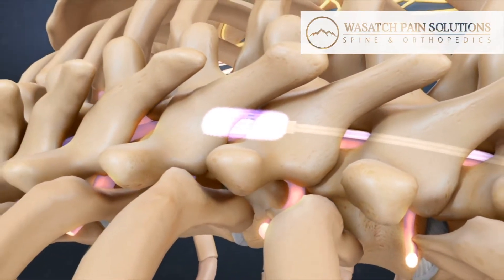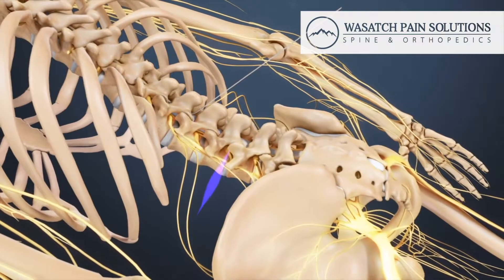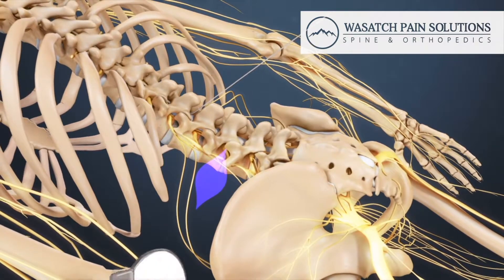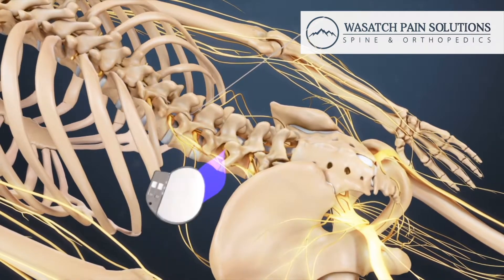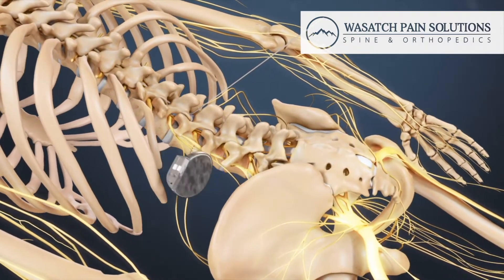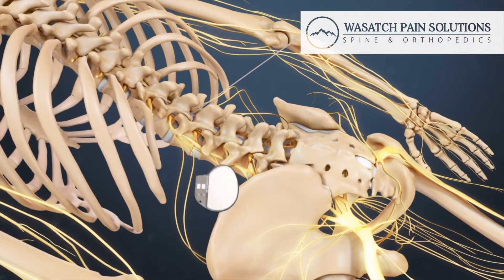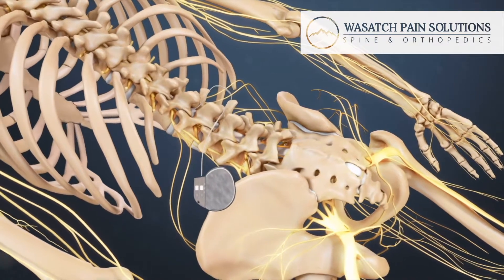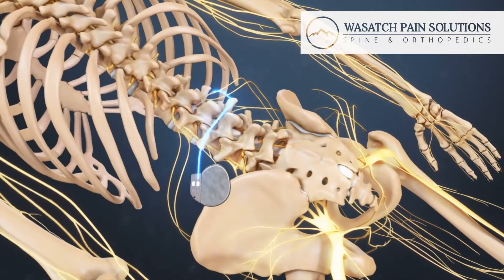Next, the surgeon creates a pocket between the skin and the muscle in the upper buttock or chest and implants a small generator. The leads are then tunneled to the generator, allowing current to flow.